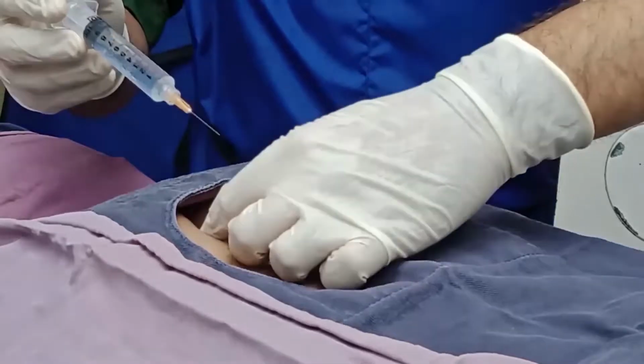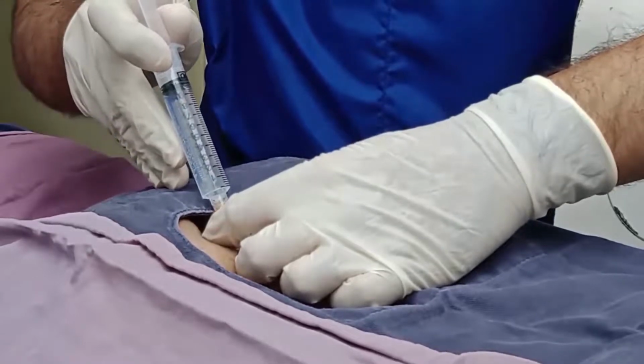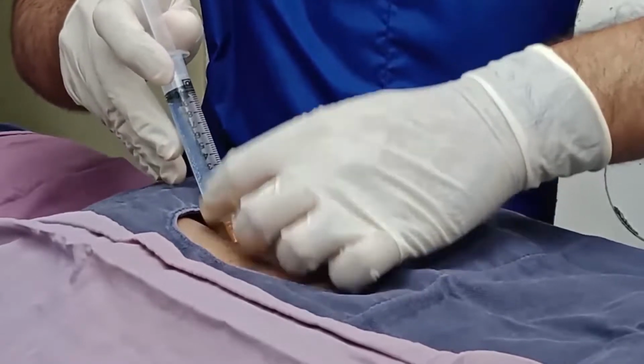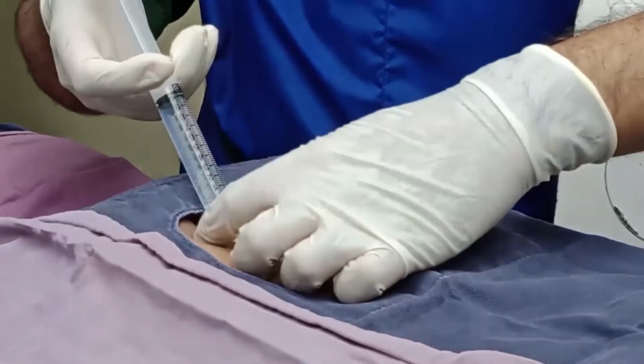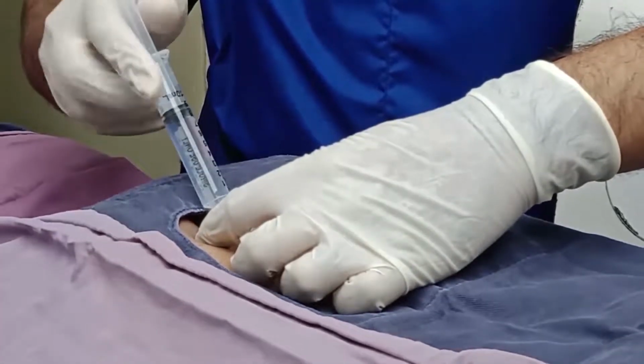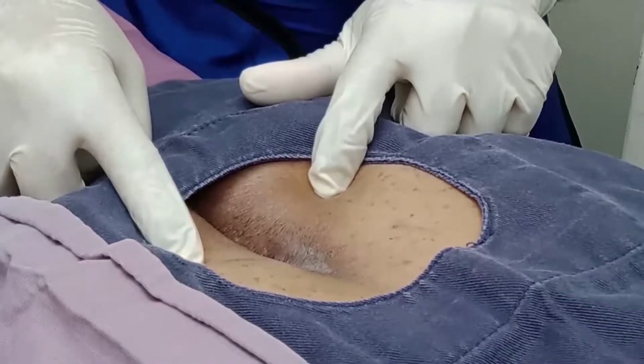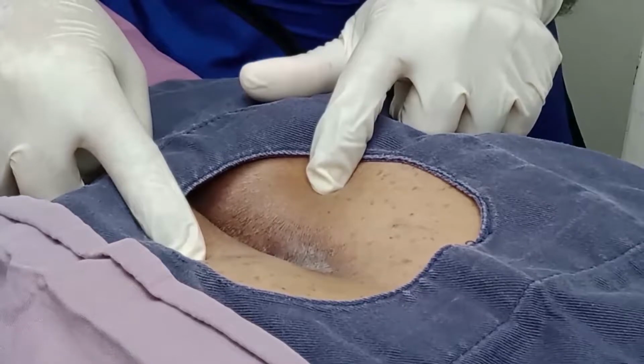On that mark, which was made with the sterile marker, a small scratch is made, local anesthetic going in. This is the 2% lidocaine which is going in. The local anesthetic after infiltration is given 2 minutes for it to work.